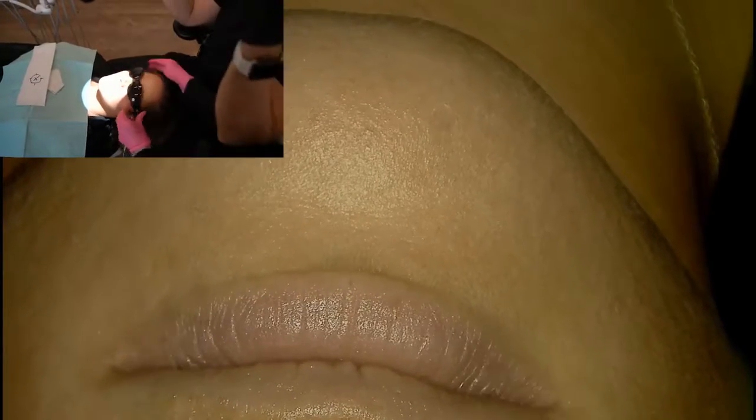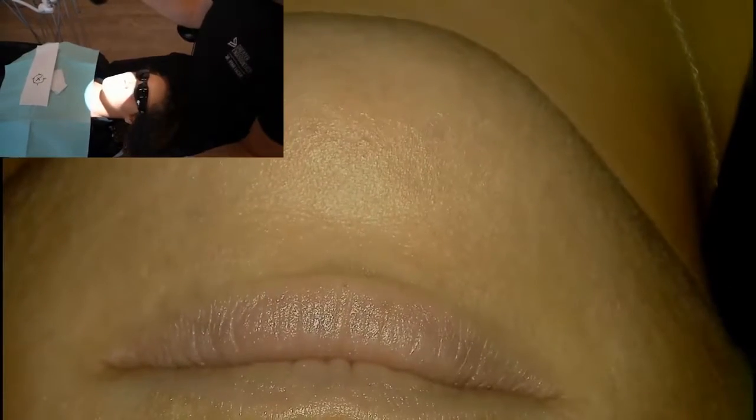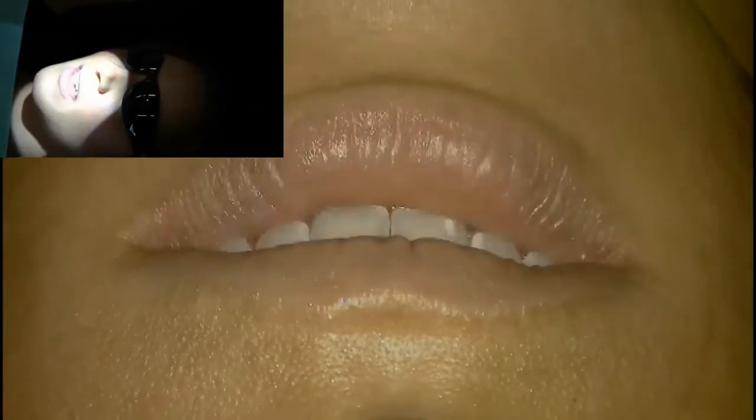I can get this back in focus for video documentation, but I certainly couldn't look in the microscope without arching my back and expanding my rib cage to stretch, which would be very uncomfortable. So you really want to know your comfortable length, and I'm about 300. I'll stretch to 350 at times, and I can put her in focus, and this is my working environment.